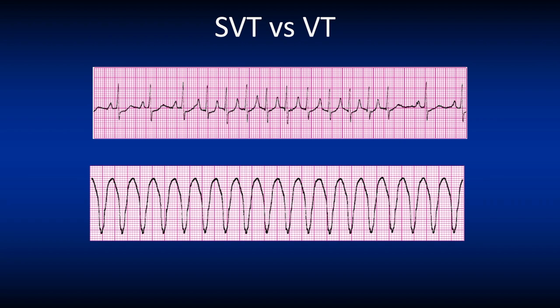Here we see the difference between an SVT on top and a VT. The SVT has a narrow QRS complex versus the VT which has a wide complex. Don't get confused between them as they have different treatment protocols.